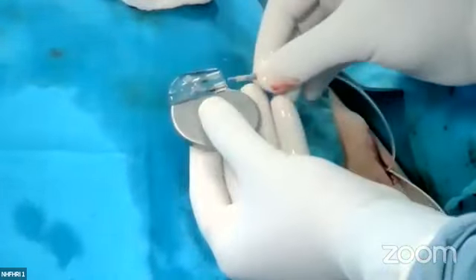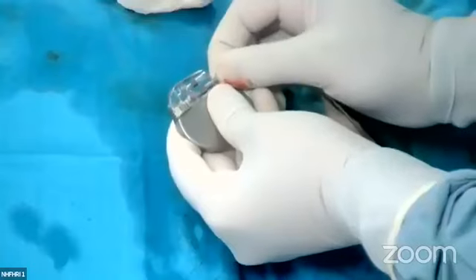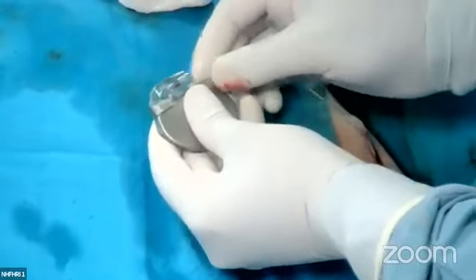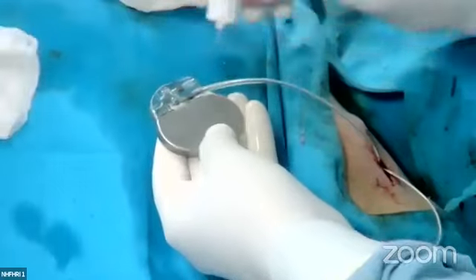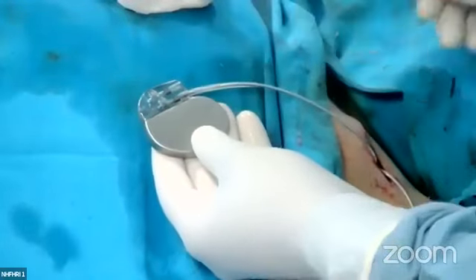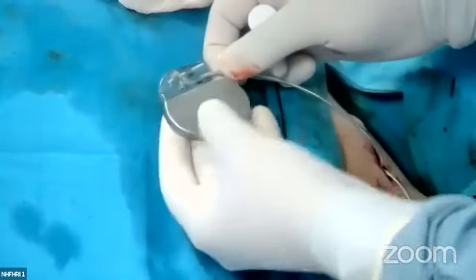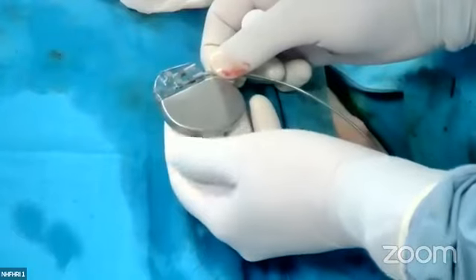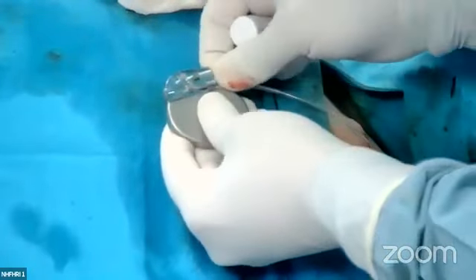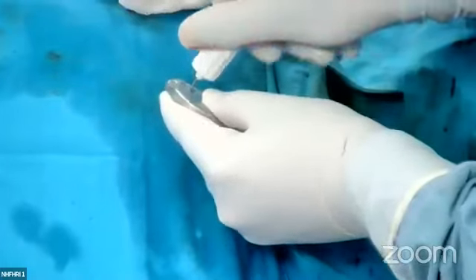This is the ventricular lead. This lead should be cleaned of blood. If there is blood, that may reduce the conductivity and connectivity with the generator. This is called the generator. Sometimes, in layman's terms, we say battery, but it includes the battery and circuit, collectively called the generator.